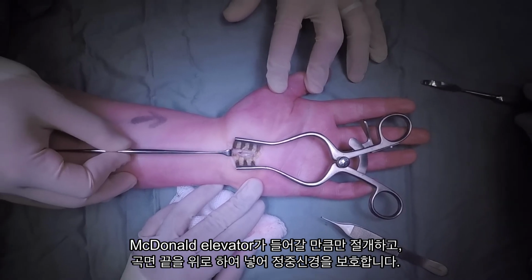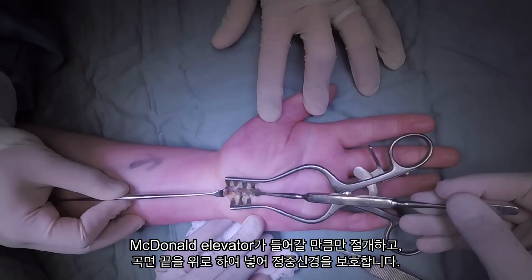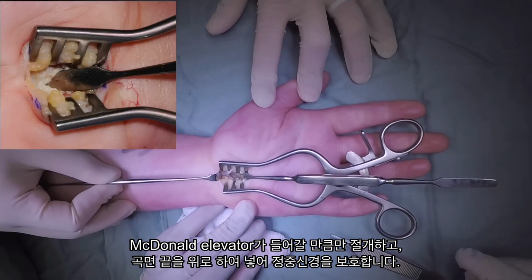Get your McDonald and, using the curved end, insert it through the opening you've created with the curved tip pointing up. This will help protect the median nerve as you divide the transverse carpal ligament. It isn't foolproof, however, so don't rely on it completely. Careful surgical technique and vigilance is still required to avoid injury to the nerve.